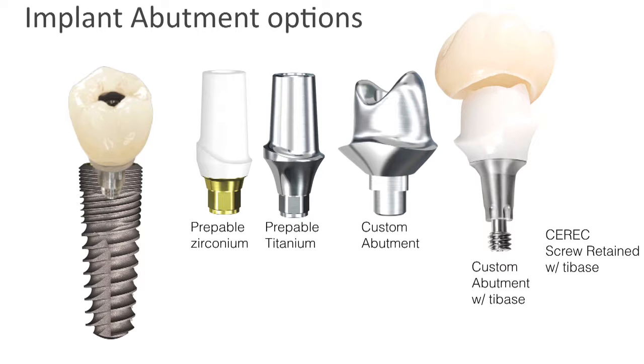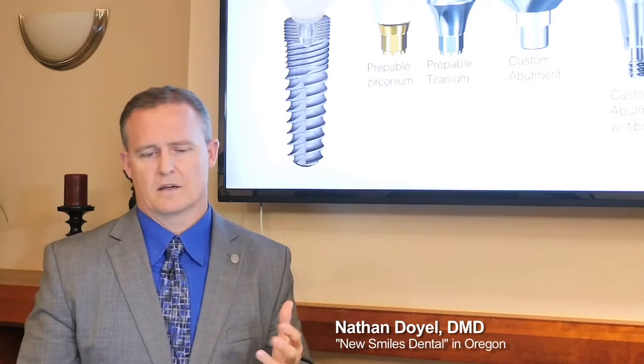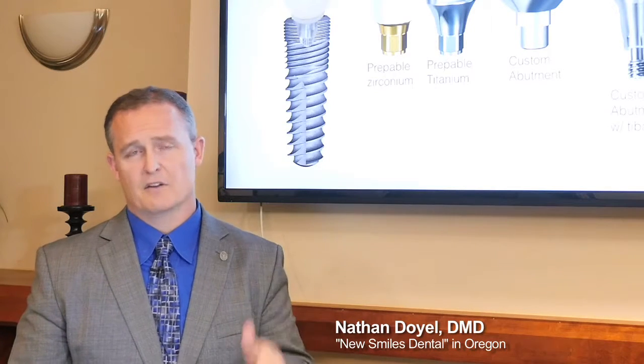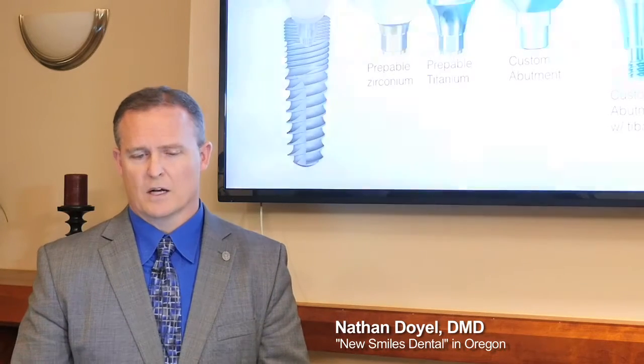Again, I'm a big fan also of screw retained. I'll talk a little bit about screw retained versus cement retained: when would you do what, and why would you do it? I prefer screw retained because you don't have to have any cement. You have one piece, the crown goes on, and then you cover up the top with a composite, and you're in good shape. I'll give you an example right here.